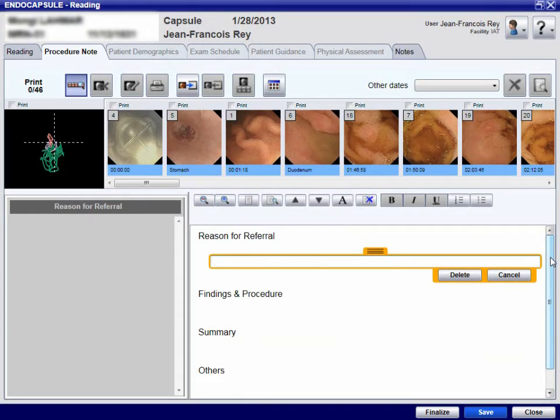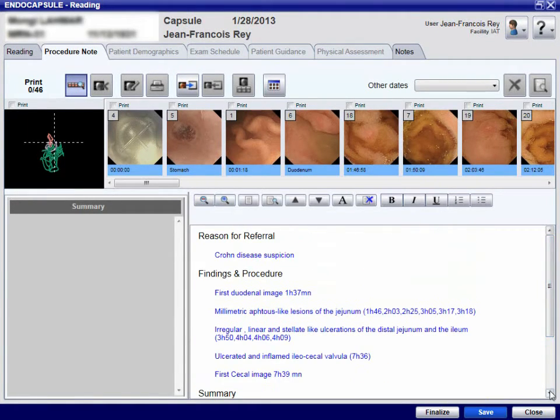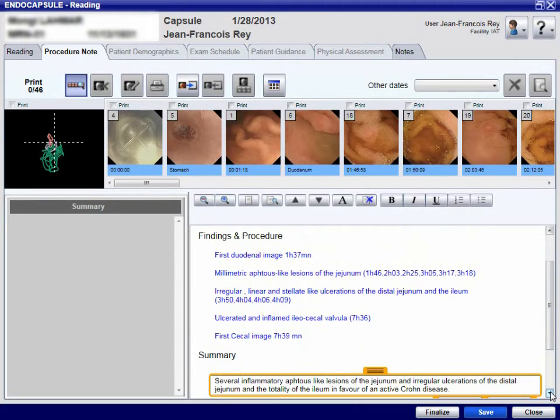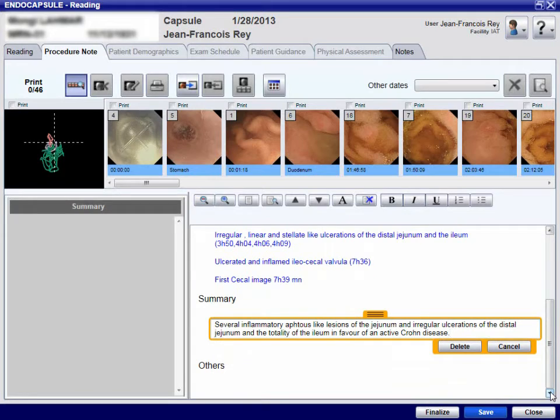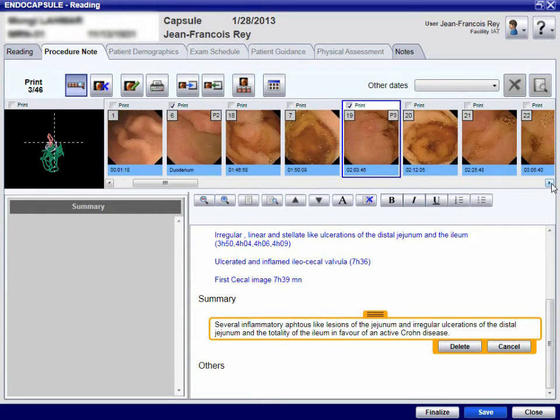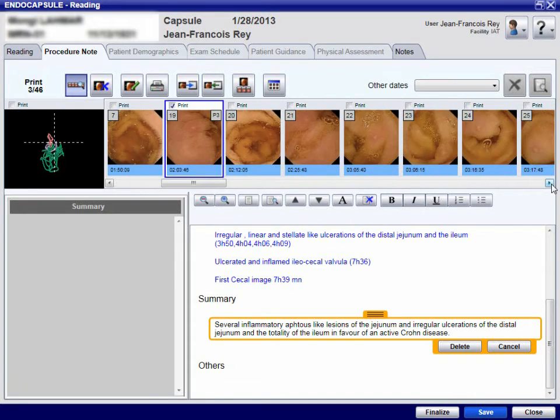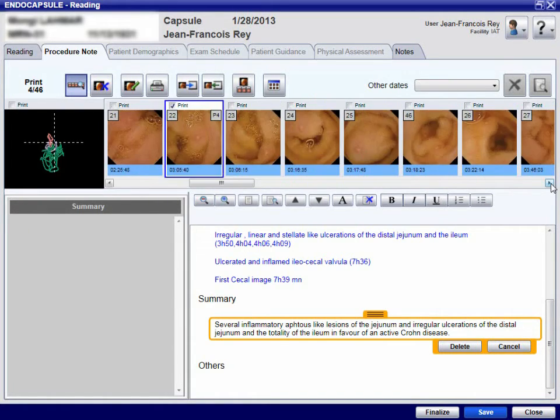In order to complete the report, adequate thumbnails are selected and included in the printed report. Medical terms stored in the software can be used to write the report. A physician's signature is mandatory before saving and finalising the video recording diagnosis.